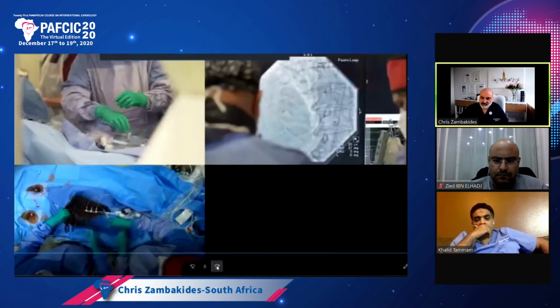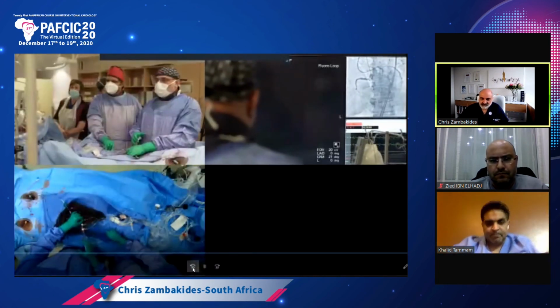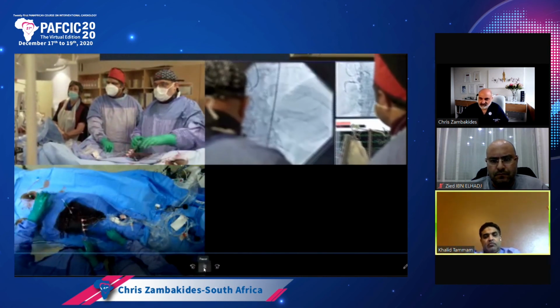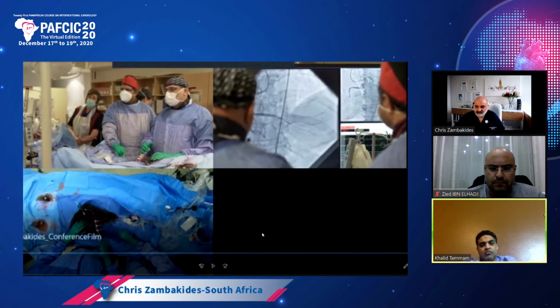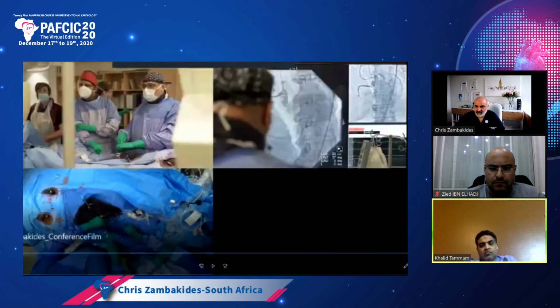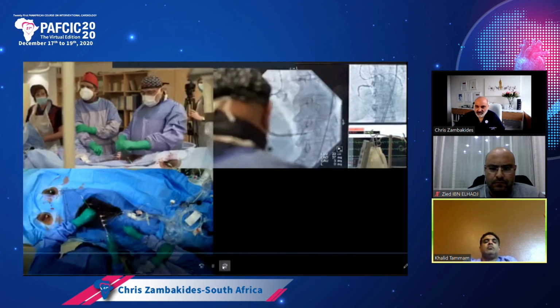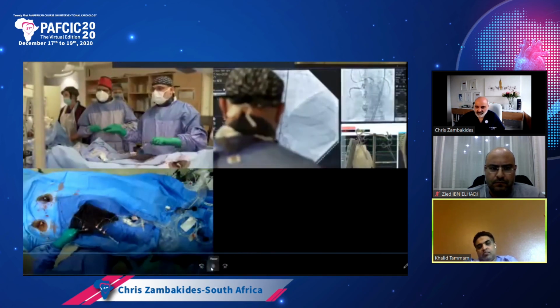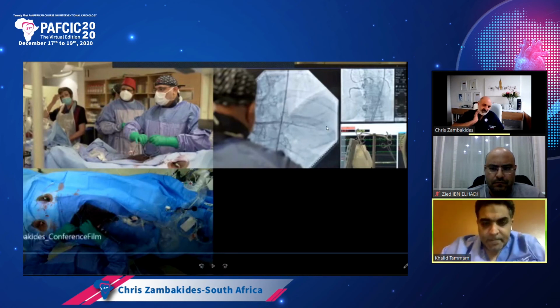Okay, give us a little bit of nitrates. Just pulling back the catheter, the PDA. Well, from nothing, I think there's something there now. And that's your final result. So you can see that there is the PLA at the top there. It's a diffusely diseased vessel, but it started to grow with nitrates.